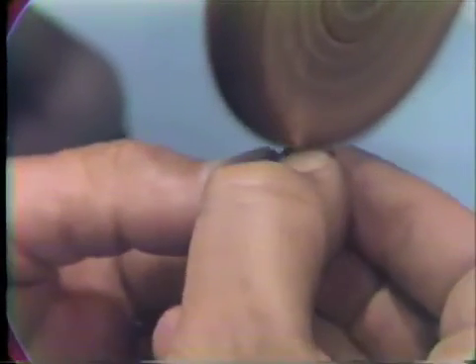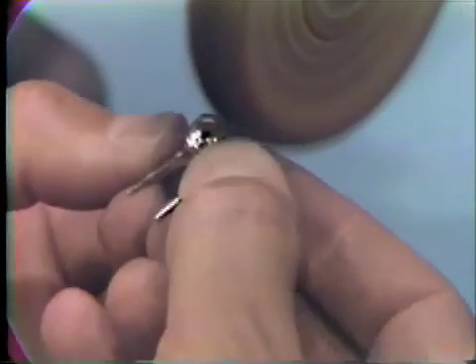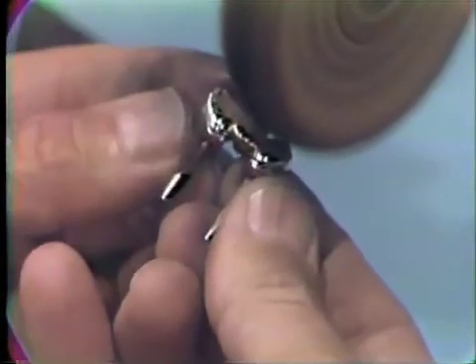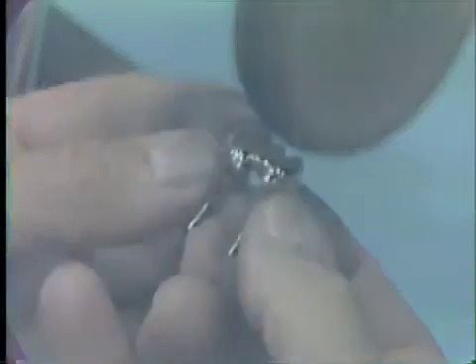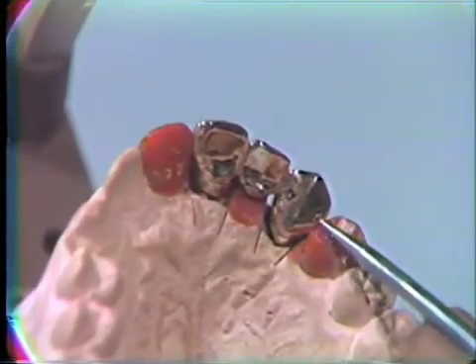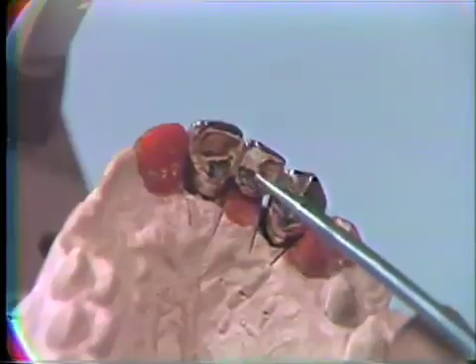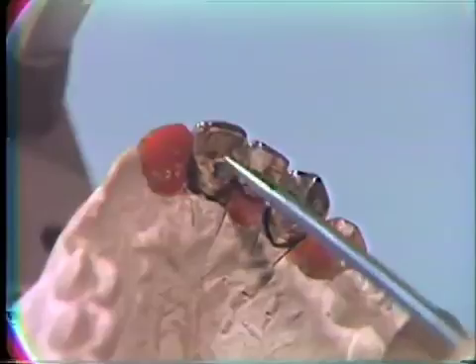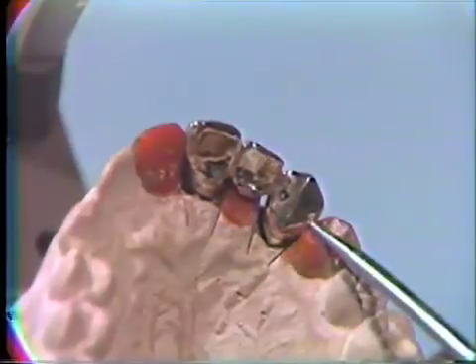The polish should be a very high grade with no scratches remaining on the gold castings. The bridge is tried back on the model and the centric stops are rechecked with articulating paper and shim stock. If these are correct and the bridge is highly polished, we are ready for the cementation procedure.